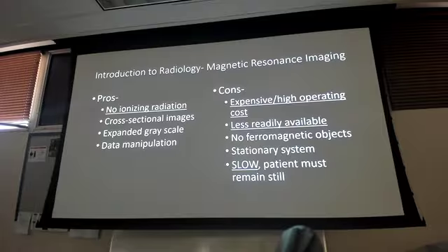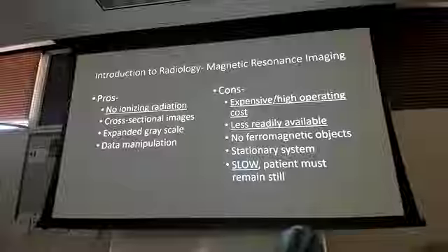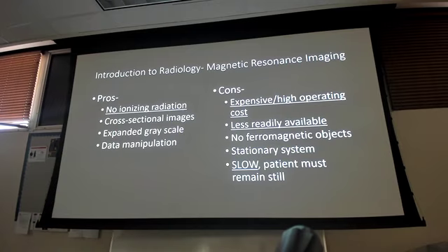So it's safe for you and I to walk in with keys in our pocket or anything like that, as long as we're out of the room before they start the actual scan. How long does it take to emergency shut it off in an emergency? Well, the magnets shut down immediately. They have a button on the outside, on their console, where they just hit it and it shuts it down immediately. Damage is probably already done, because it doesn't take much once these magnets kind of kick on.